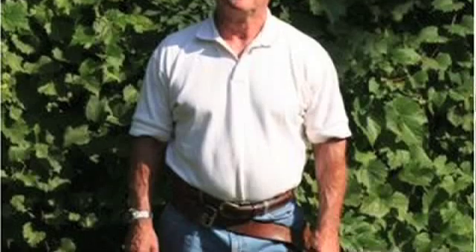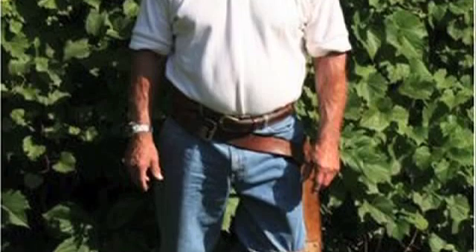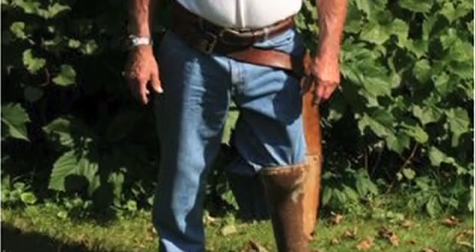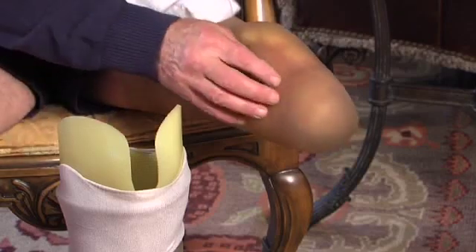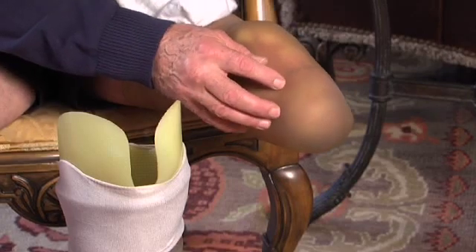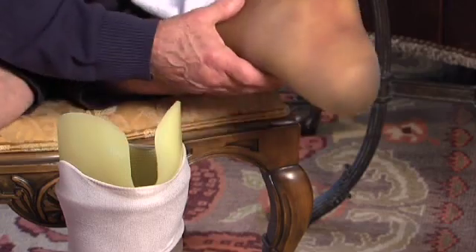I've been an amputee for 54 years and I've worn everything from what was available from World War II to present. A lot of the issues came from socket technology — the shearing, the high load pressures, the dissemination of forces not being gradual. So I developed a urethane liner system that you wear rather than a sock, and that goes inside the prosthesis and acts as a shock absorber and a buffer between you and the rigid socket.